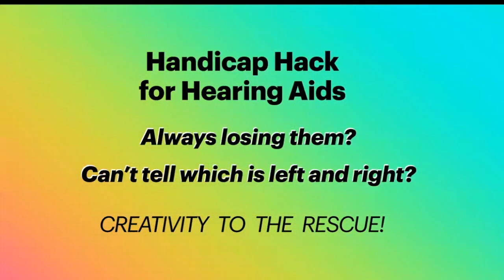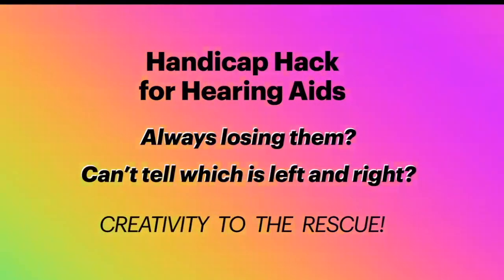Thank you for joining me for my handicap hack for hearing aids — for people who are losing them or can't tell which one is left and right. We are going to solve this problem with creativity.